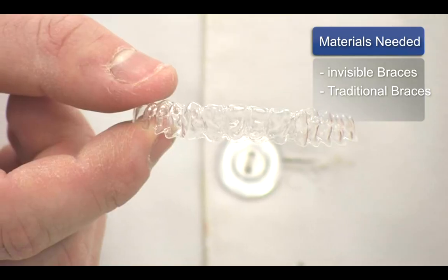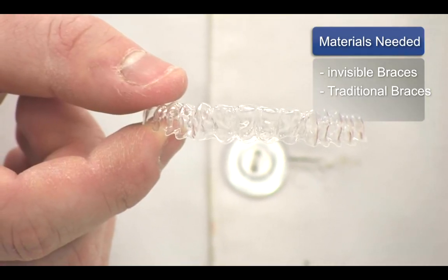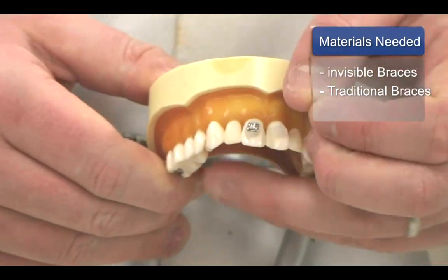For materials being used, depending on the sort of braces that the patient is put in, it can be something as simple as the invisible retainers, such as Invisalign, or more involved with the metal and bracket wires.